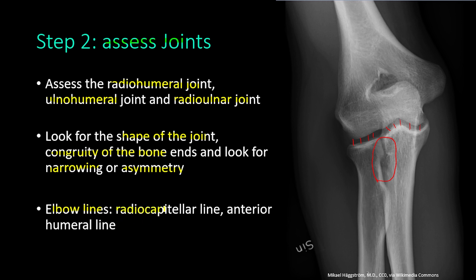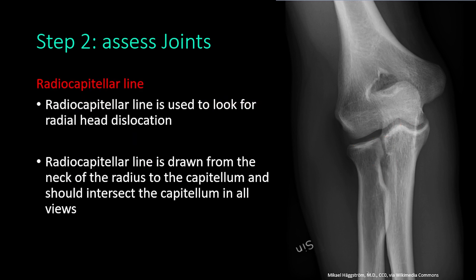We also check the elbow lines. The first is the radio-capitellar line, which is used to look for radial head dislocation. It is drawn from the neck of the radius to the capitellum and should intersect the capitellum in all views. On this AP x-ray, drawing from the radial neck toward the capitellum, we can see it intersects normally.